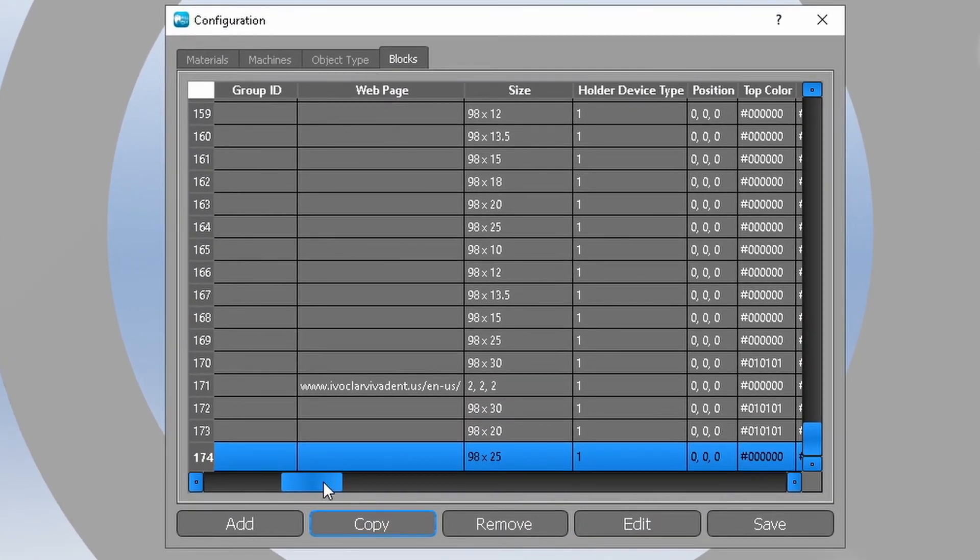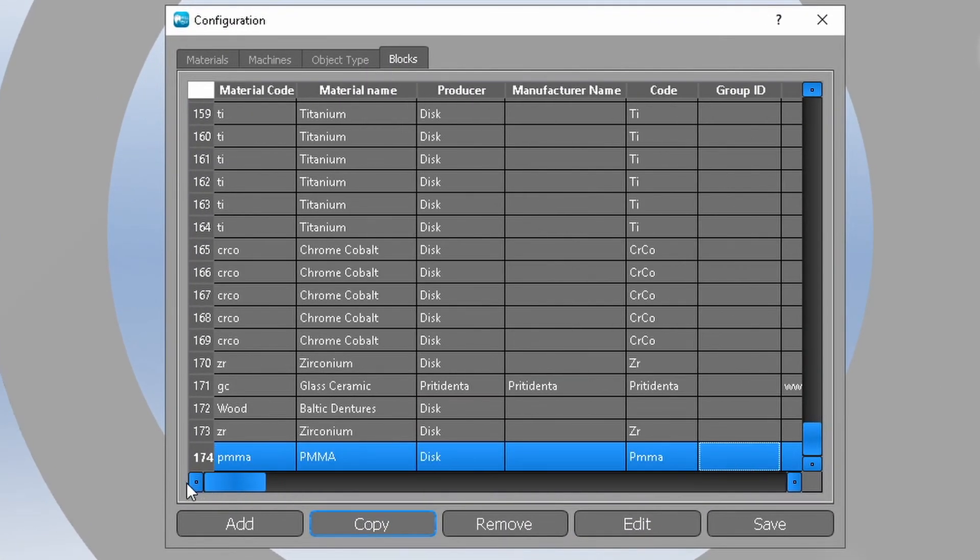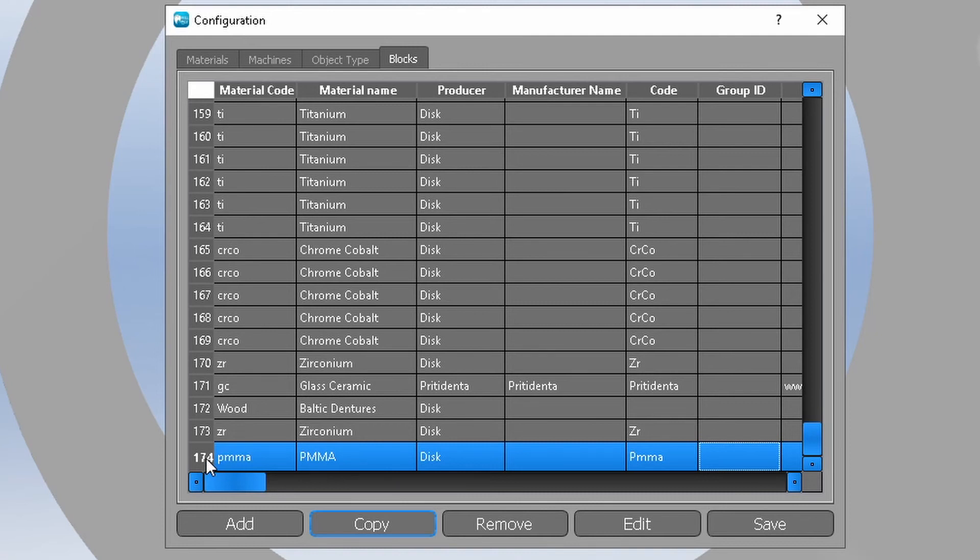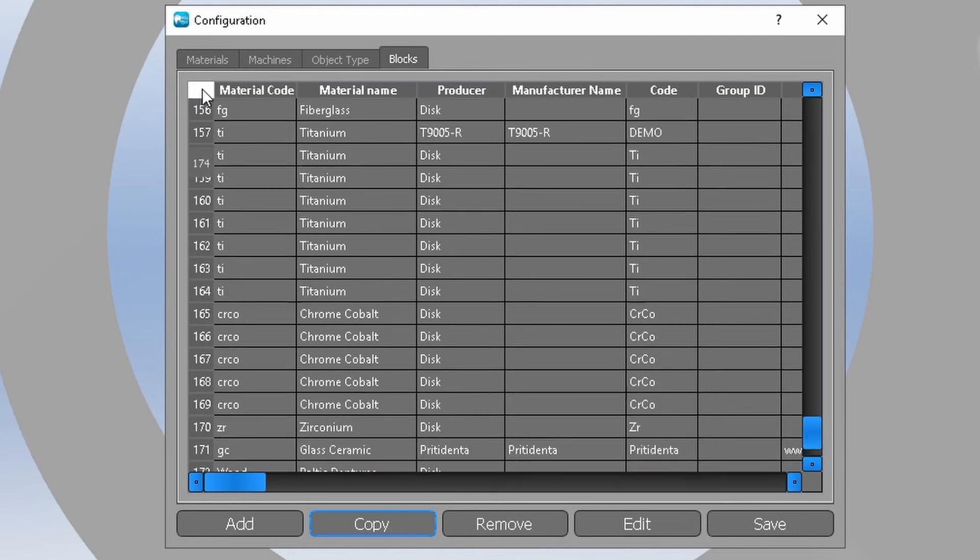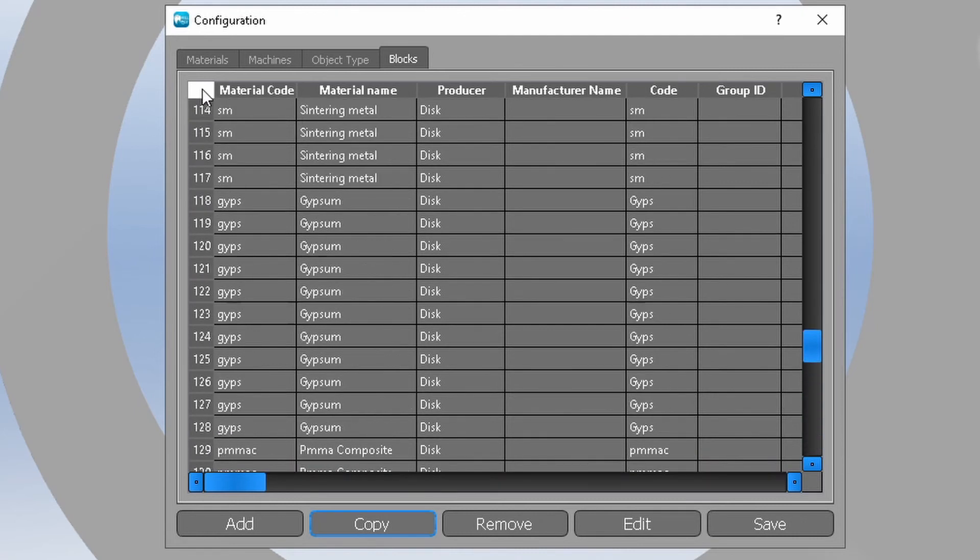As default, Millbox adds newly created blanks to the bottom of the list. If you like to have the list organized, you can click and hold the cell with the line number and then pull the line to another place in the list.